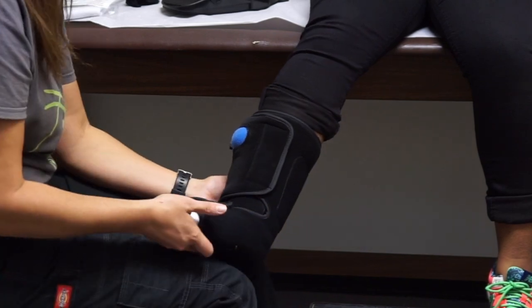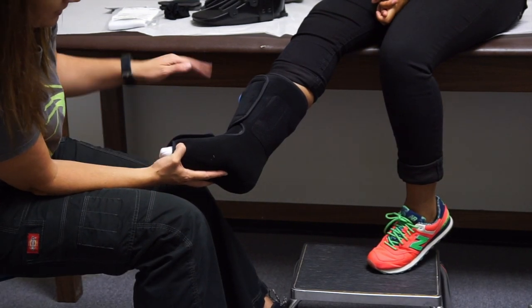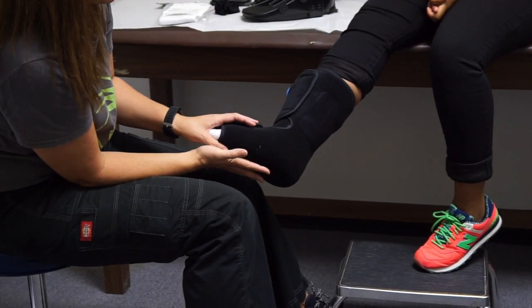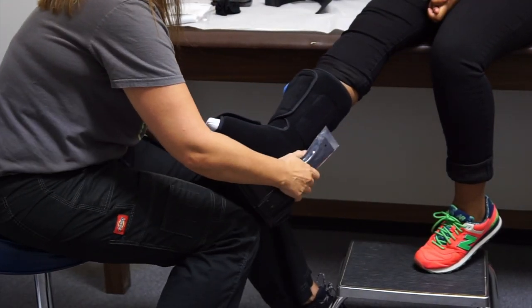The important thing is that we maintain a 90-degree angle at the ankle. If the patient is farther than 90 degrees and they're plantar flexed, this is going to shorten their achilles tendon and we can have issues long term. So we want to do our very best to get them at 90 degrees — it's difficult for some patients, especially with an acute injury, but that's our goal.